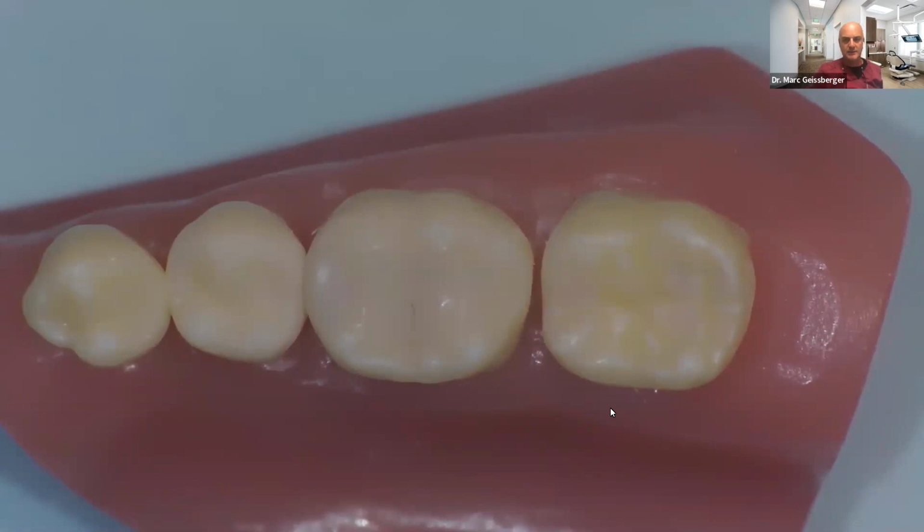It's what seals the dentin. It's what provides us no microleakage. And I always want to make sure that that being the absolute deepest gets the most amount of curing. Now you could do it for 10 seconds, but I prefer a 20-second cure on my adhesive just to ensure that I got the light to the absolute deepest part of the prep.